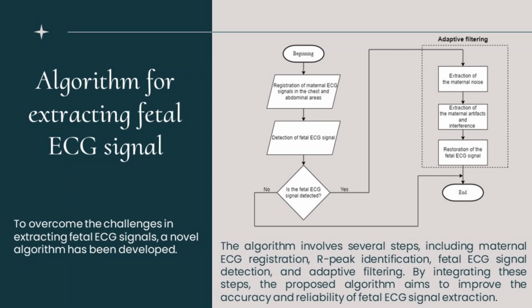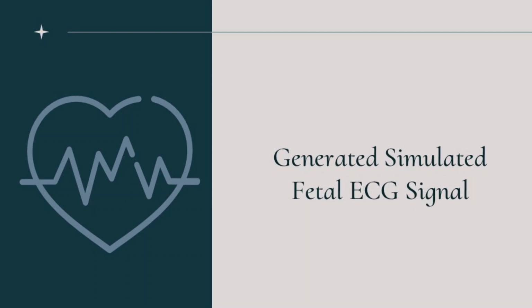If fetal signals are detected, the algorithm proceeds to the third step, which involves adaptive filtering to remove maternal noise and enhance the fetal ECG signal. The filter coefficients are updated in real time based on the maternal, fetal, and noise components. Let's move to the generated simulated fetal ECG signal.